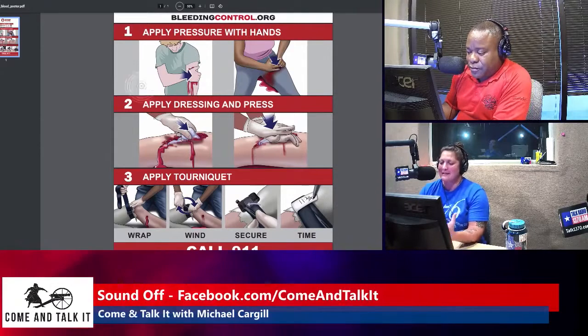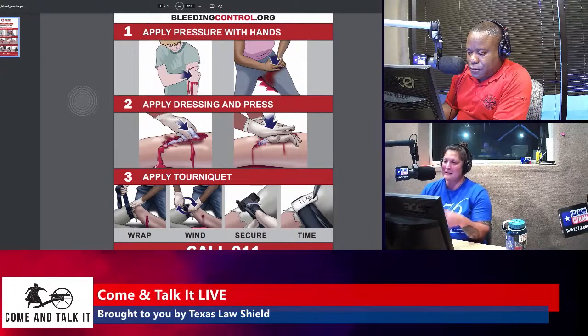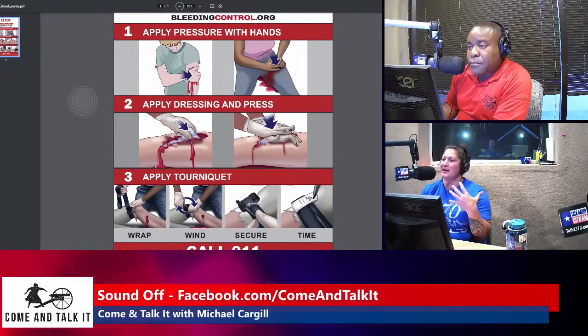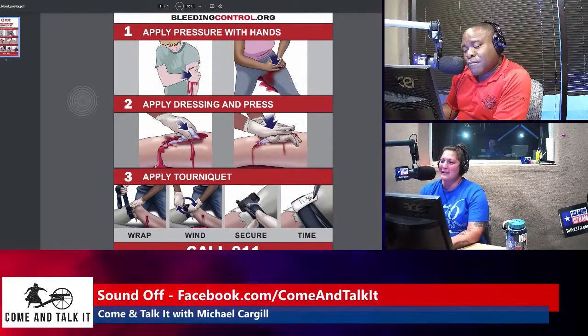Right. But then I'll bring our wound packers. So I have some new wound packing material from Rescue Essentials and True Clot. So we'll actually play with blood and get to make some clots. So we get to see what we're looking for in that wound packing skill. So we're going to be putting fingers in holes, playing with blood, and it's going to be good stuff.